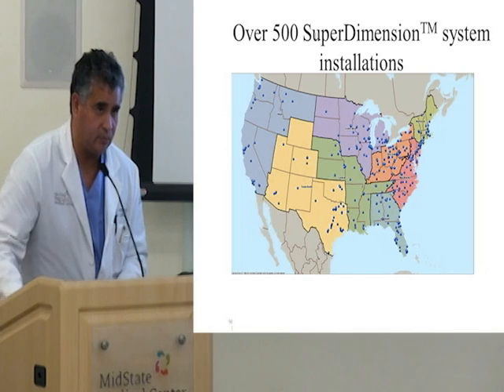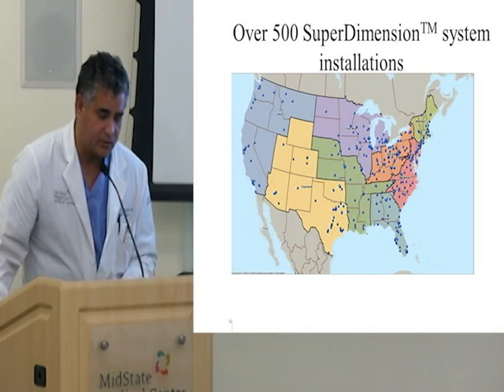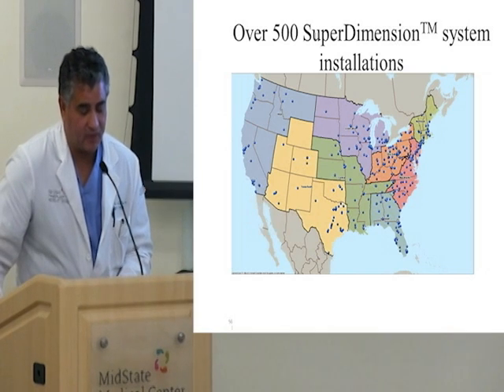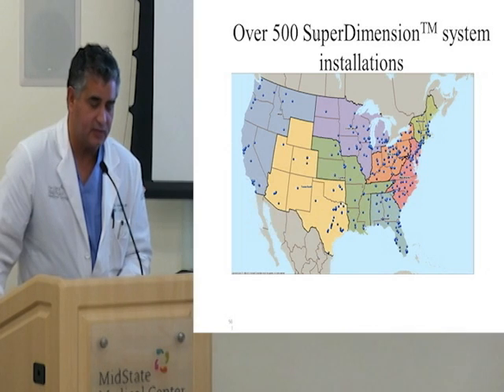This is starting to be more broadly applied throughout the country. You can see, as in most things, the Northeast are early adopters. This is where I introduced it up in Maine before I came here. And it's still fairly poorly penetrating in the West, but that's going to change.